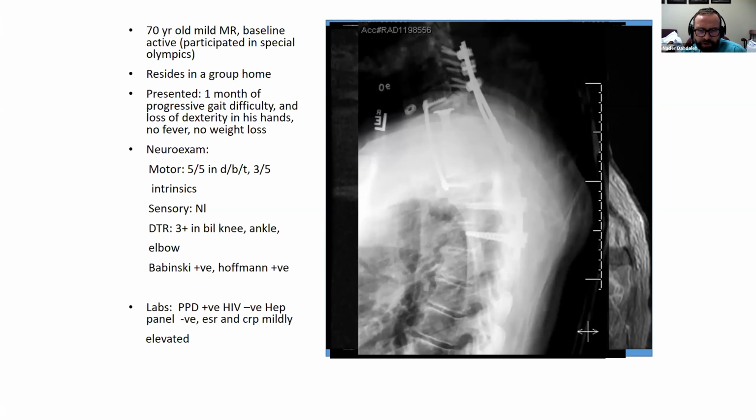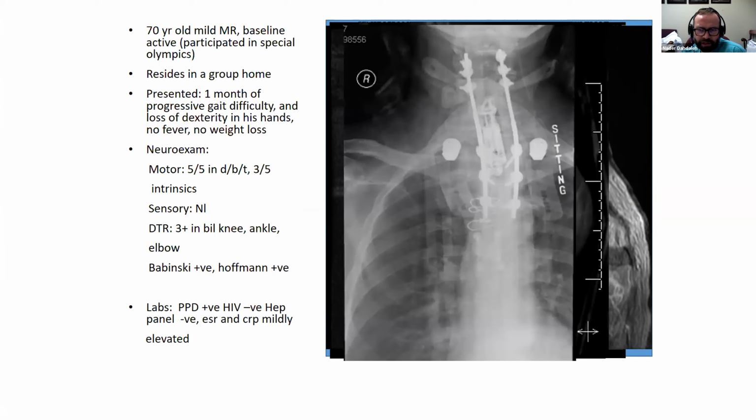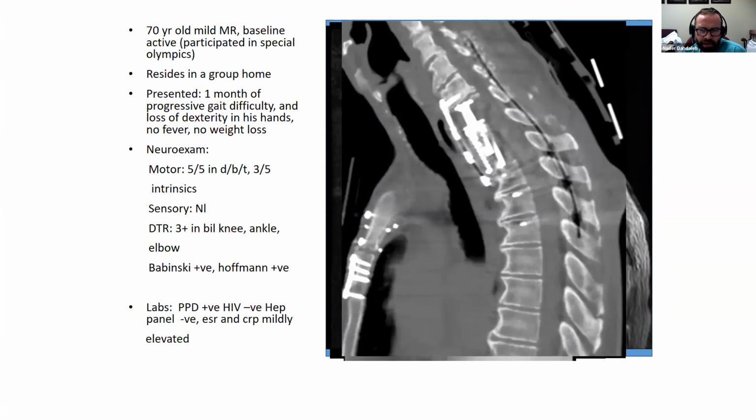And then we did a front-back. Definitely put the patient in a little traction to help keep that alignment, and then use an expandable cage for that. He did ultimately well.